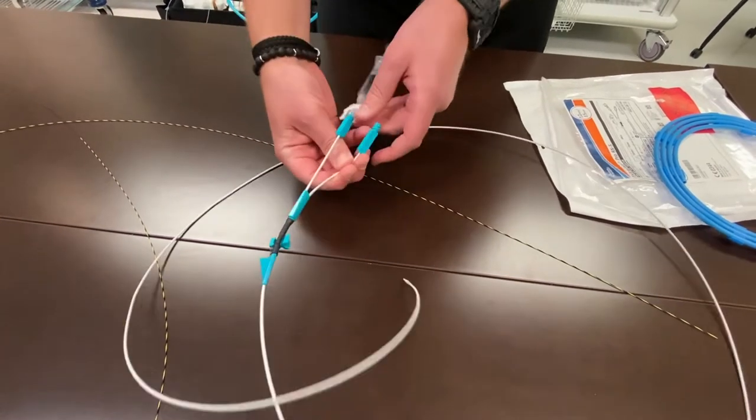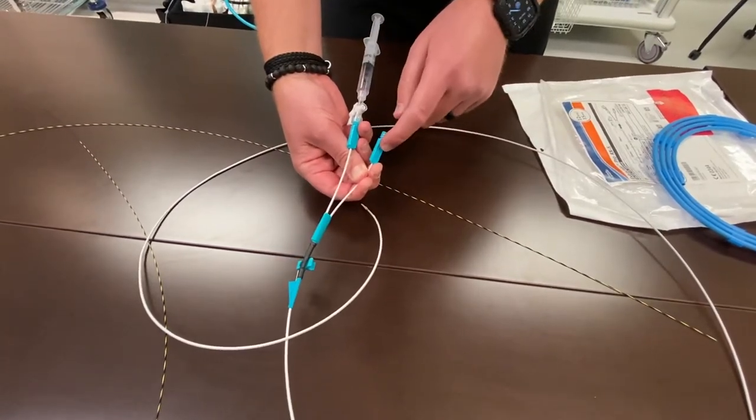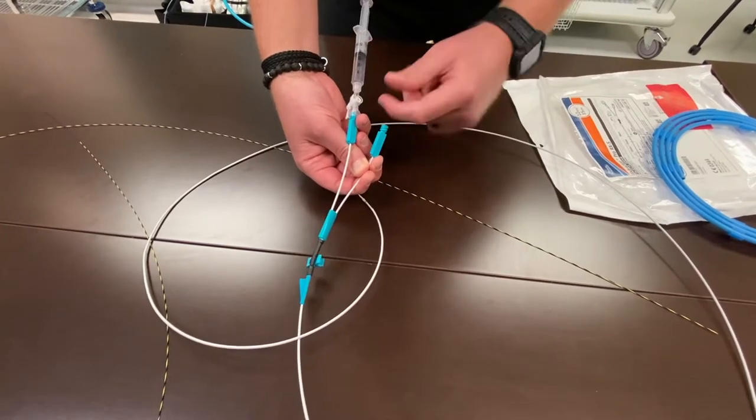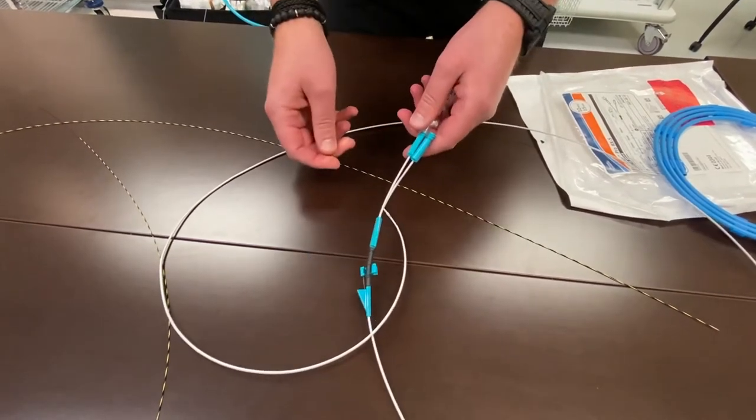And then we're also going to connect our contrast syringe to the injection port. We're going to flush contrast through it to prime the device with contrast.